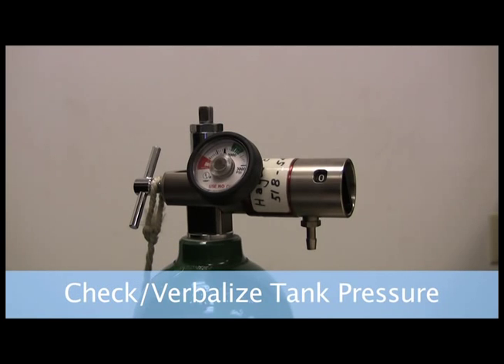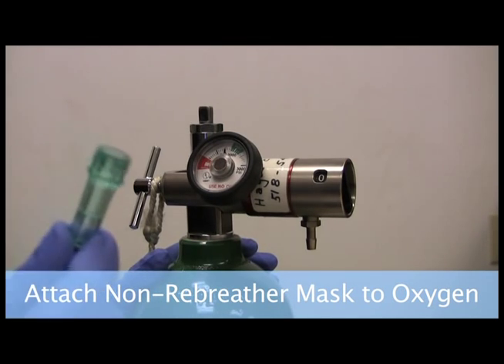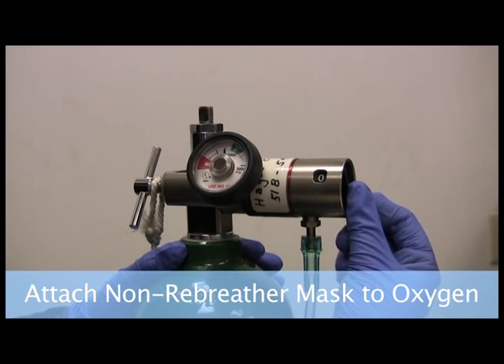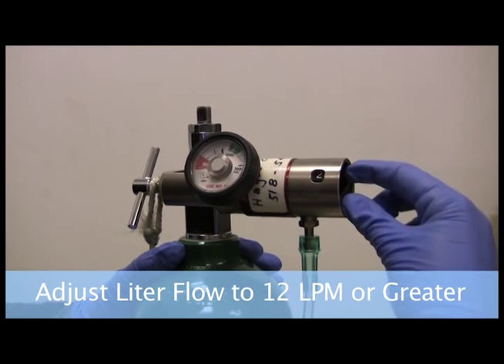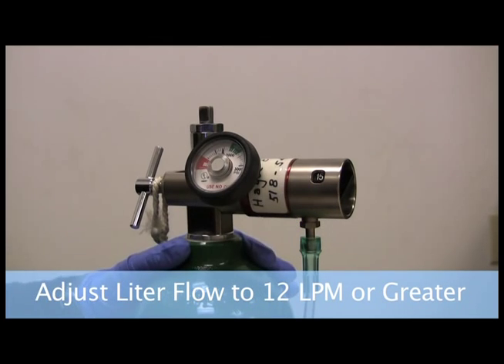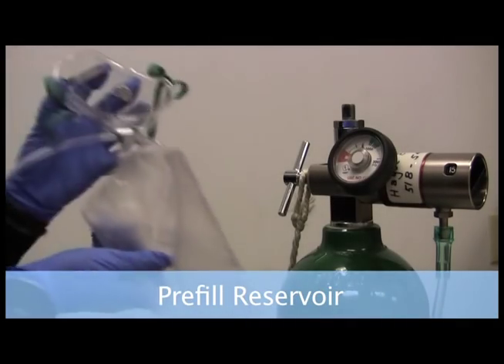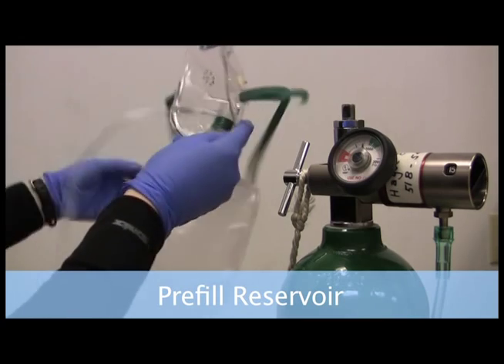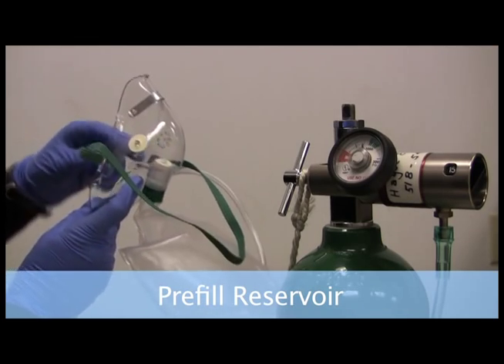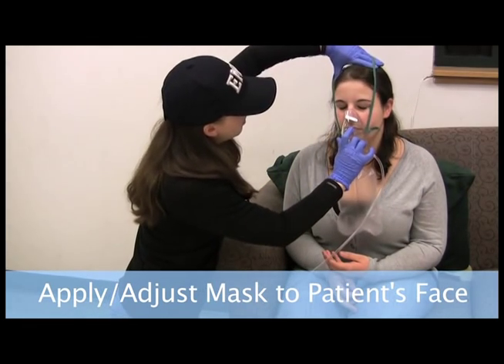So we want to hook up the oxygen mask. What we're going to do is take the end of the tubing to the oxygen, put it on there nice and firm, and with a non-rebreather, I'm going to put it up to 15. You see we're at 15, and now, to fill up the mask, you're going to just push into here, and the mask will start blowing up, and you'll go ahead and put it on the patient. So to put the mask on, I'm just going to go around the head.